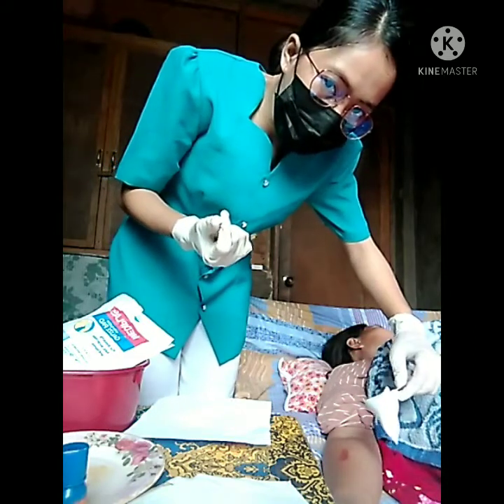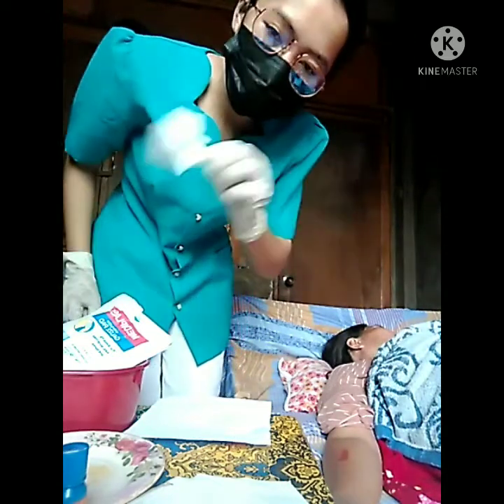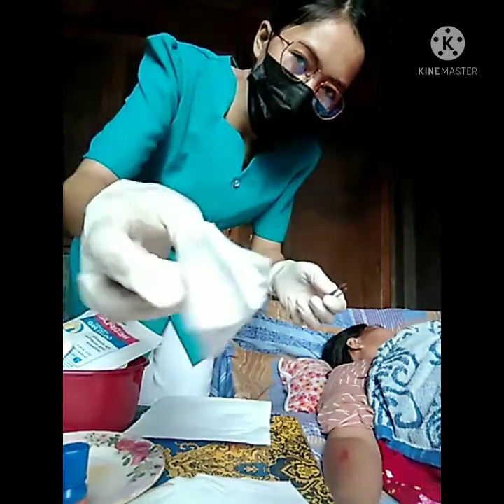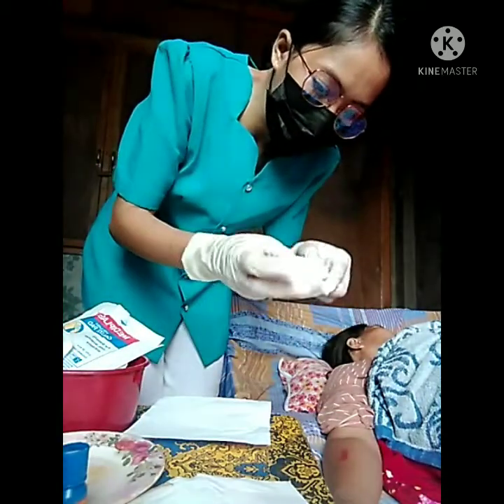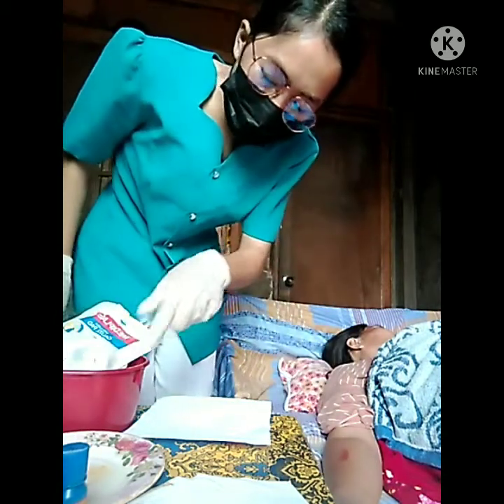Use one firm long stroke to dry. Then put it in the waste receptacle, and then use another sterile gauze and dry also. Then put it in the waste receptacle.